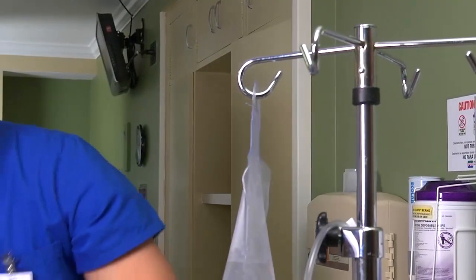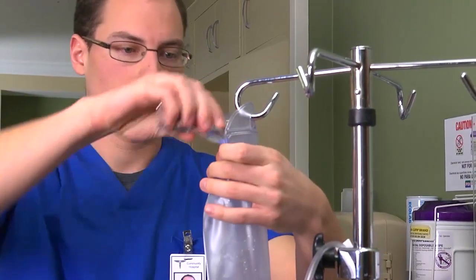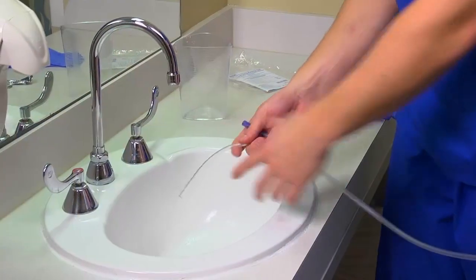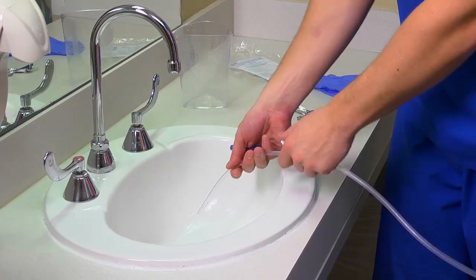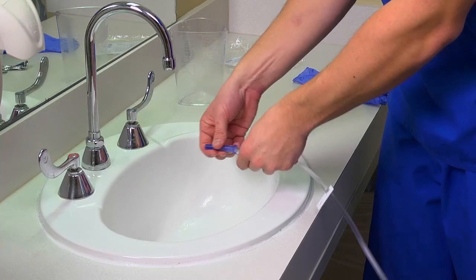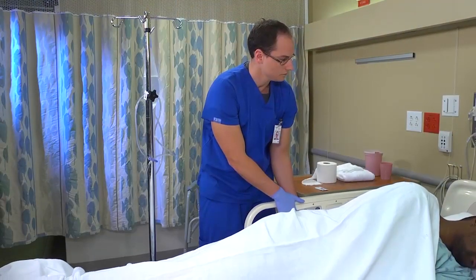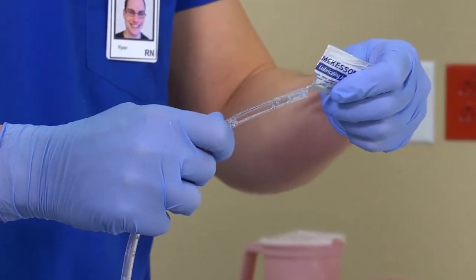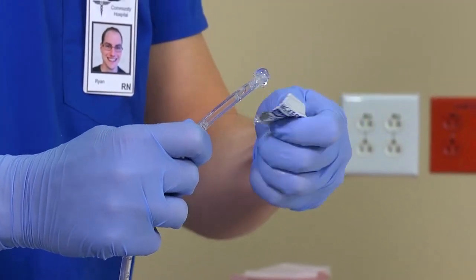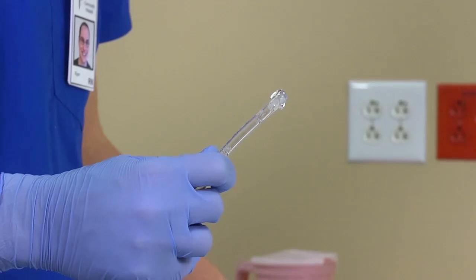If a soap suds enema has been ordered, add Castile soap after the water is placed in the enema bag. Next, raise the bag, release the clamp, and let the solution flow just until it fills the tubing to push the air out of it. Then reclamp the tubing. When the enema and the patient have been prepared, you may apply a little more water-soluble gel to the pre-lubricated tip.